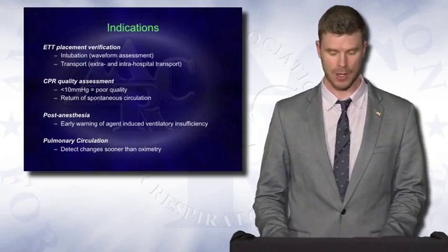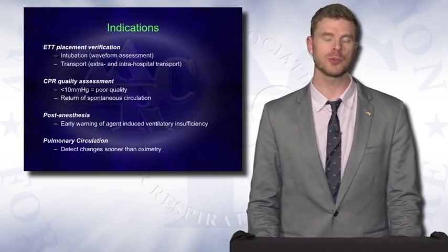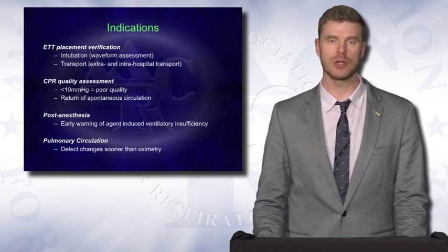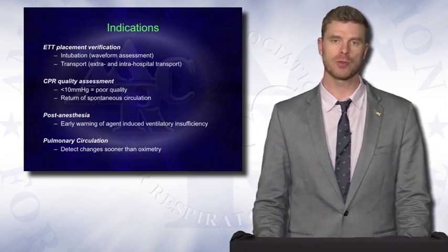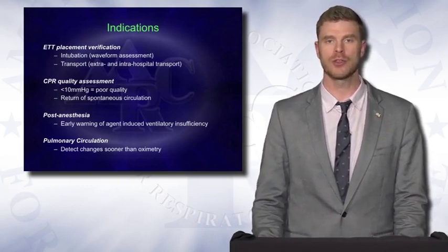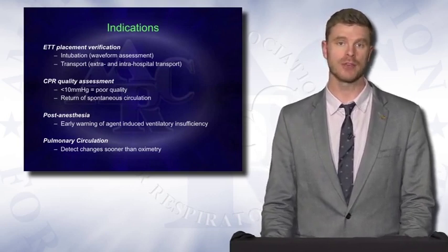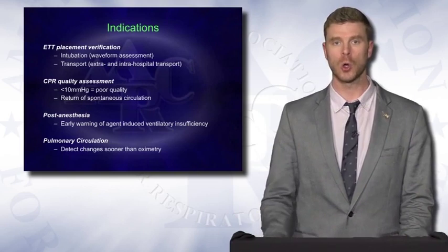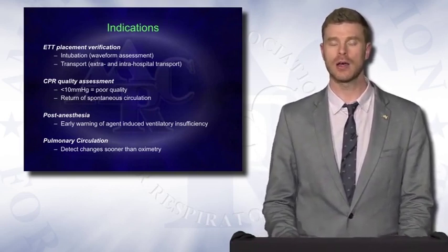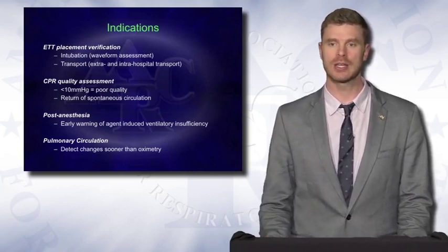Post-anesthesia. As patients are increasingly taken from the OR to recover in other areas of the hospital or are having sedatives or other drugs that may impede respiratory function on the floor, CO2 monitoring is an important tool for us to ensure that the patient is maintaining their respiratory system appropriately. In this case, the devices can be applied non-invasively if they're spontaneously breathing or invasively on a mechanical ventilator. And really what we're looking for is the presence of a substantial amount of CO2 and no sudden decreases in that concentration.